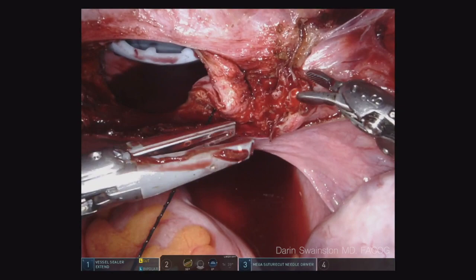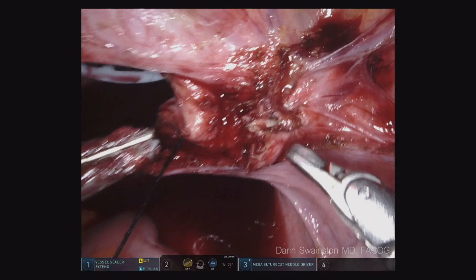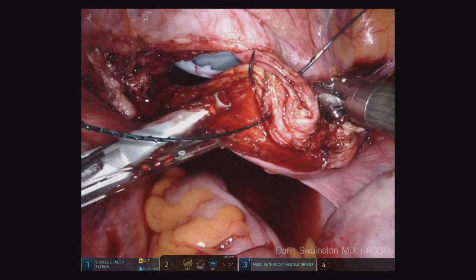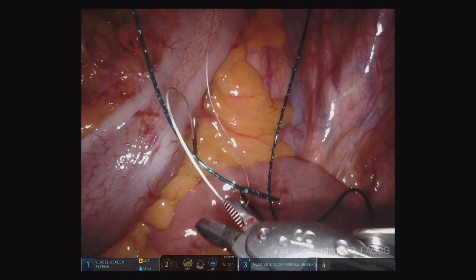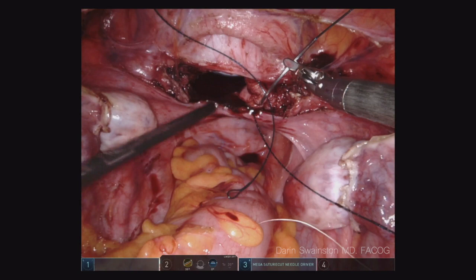There's a little bit of oozing coming from that vessel, so I'm going to go ahead and just grab it with the needle driver — then you're pulling up. There's less risk of injuring the ureter. Once I've gotten that cardinal ligament out lateral, a nice healthy bite, then I go a little more superficial. I'm just trying to get the vaginal mucosa. Another thing I'm showing here is if your hospital or you are cost conscious, you can use the vessel sealer extend as a grasper. The company doesn't recommend it because they don't have FDA approval and can't guarantee the device after grabbing metal, but I think it's fine as long as you know that and are careful with it.